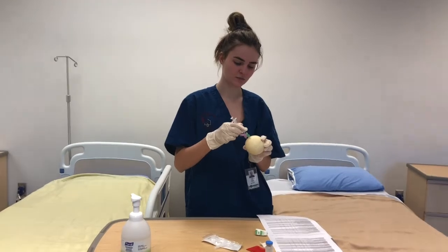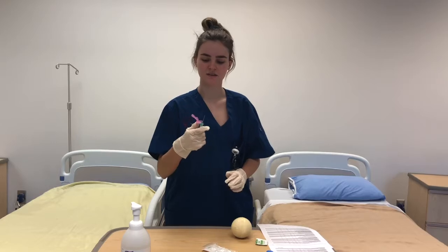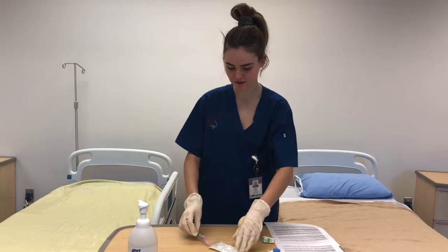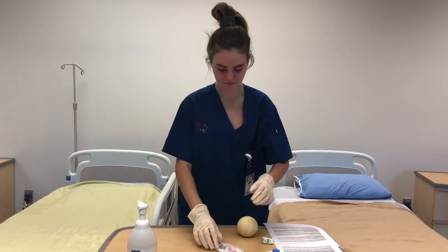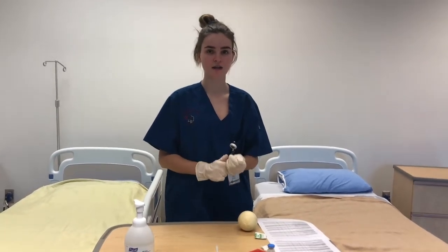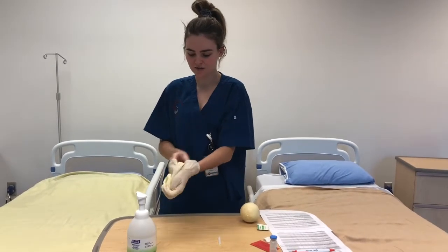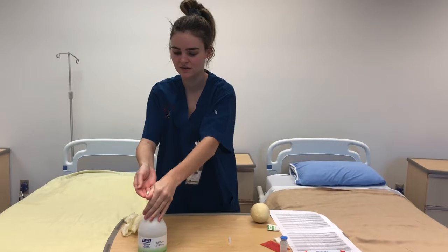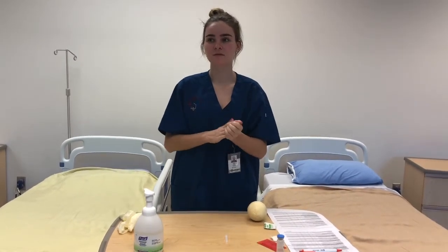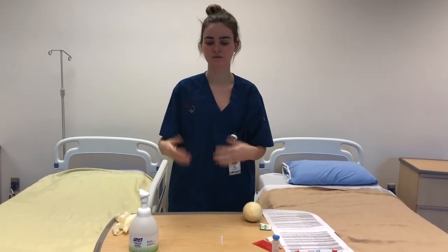So once it's all in, you'll be removing the needle and pushing the cap onto the needle. And so this will get discarded in the sharps container. All right, so now that both of Mr. Mancini's medications are done, which was heparin as a subcutaneous injection and Haldol as an IM injection, I will be removing my gloves and performing hand hygiene. And I will record this in his MAR and closely monitor the patient for any signs of infection or adverse reactions to the medication.